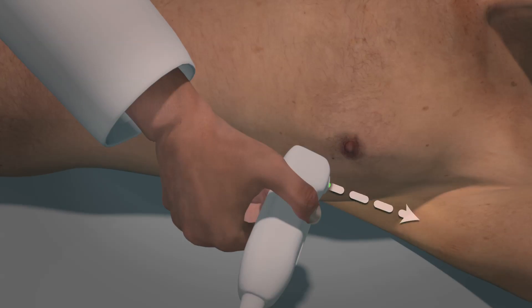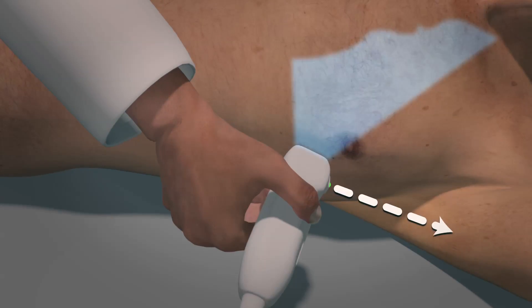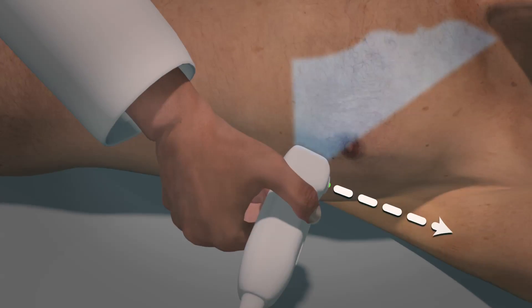The probe marker should be pointed toward the patient's left shoulder. The ultrasound beam should be pointed toward the patient's right shoulder.